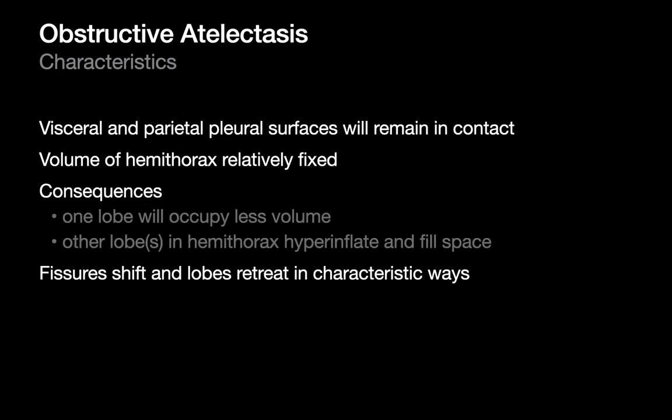When obstructive atelectasis occurs, it happens at the lobar level, and lobes collapse in very predictable ways. It probably takes about 24 hours of airway obstruction for these signs to manifest. There are five prototypical appearances of obstructive lobar atelectasis to recognize. If one lobe collapses, other lobes will expand to fill the space, and fissures will shift in predictable ways.